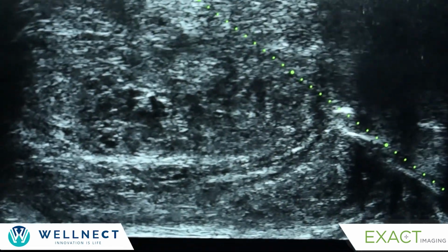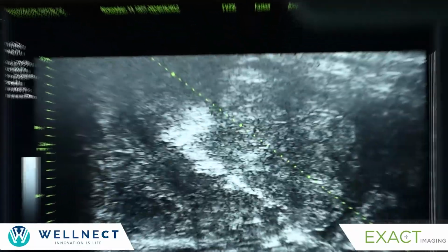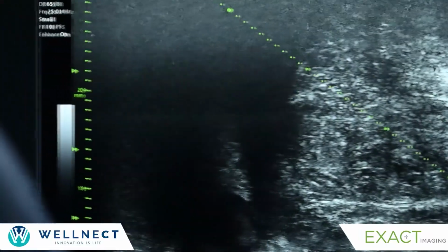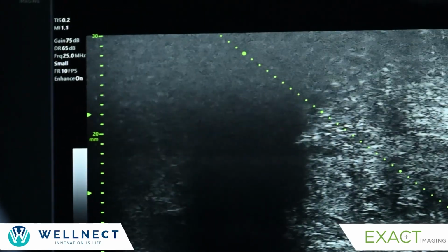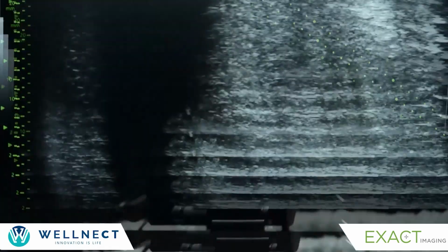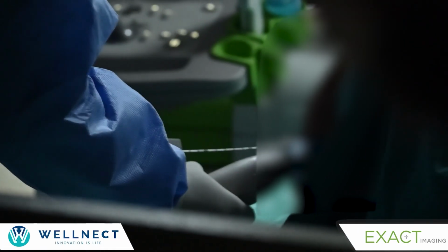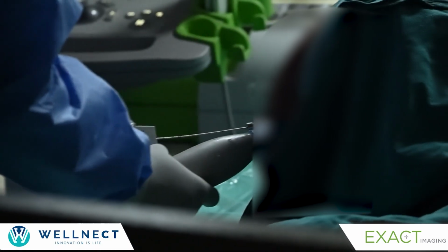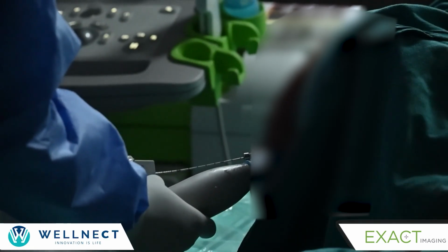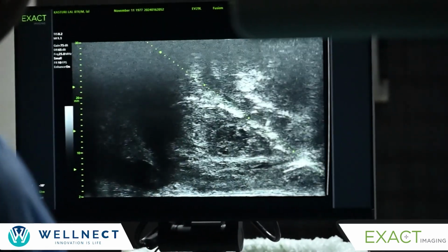I have come till the prostate and then I fire. That is how you get this. Now I want to come at the base. So this is the base. Again, I traverse the rectum, this space between the rectum and the prostate. Come over here, and then I see I am in the substance of the prostate, and now I have taken the lines.